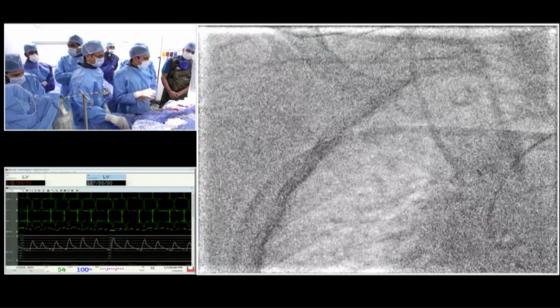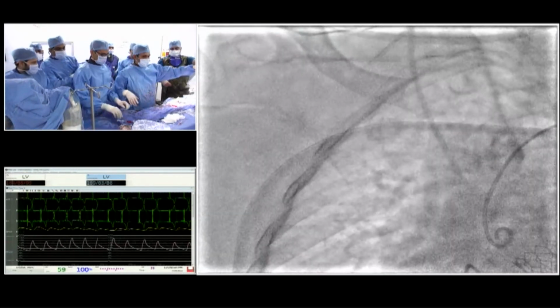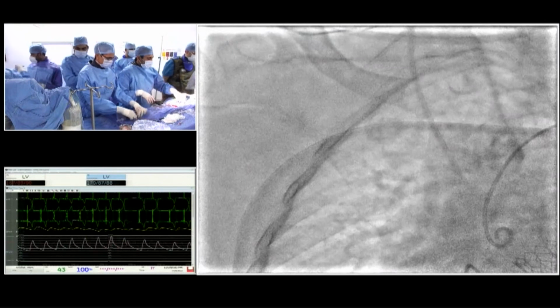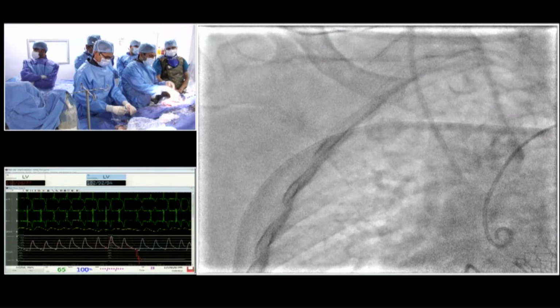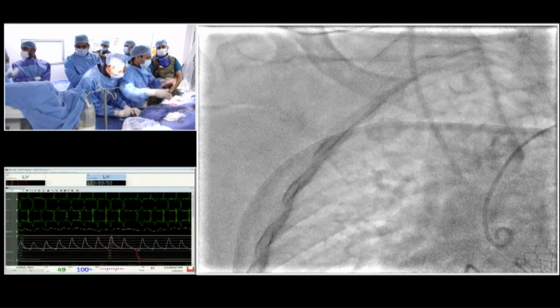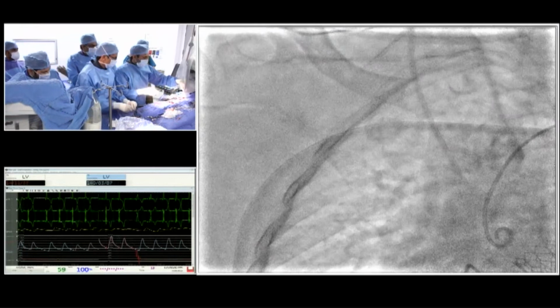Okay, so now I think we have time. We're going to go ahead and show one ProGlide and one AngioSeal as well. People like to see whether you captured anything. Come down to the filter, please. Can you focus on that? Is there any material in that filter? Yeah, we will show that. Let's do that filter, please.